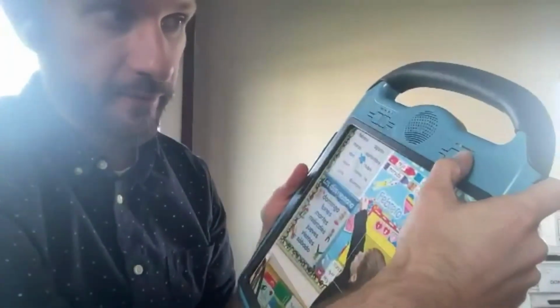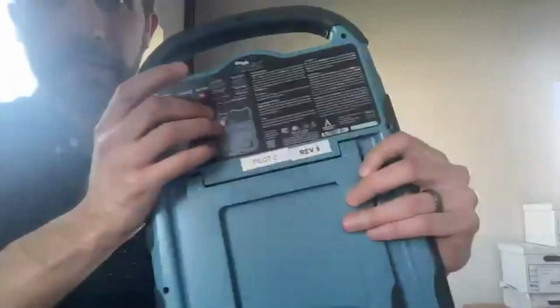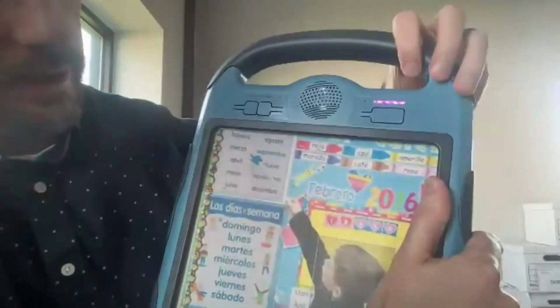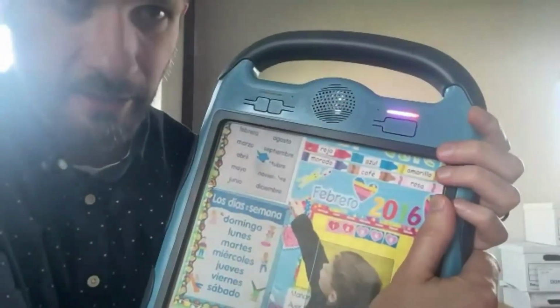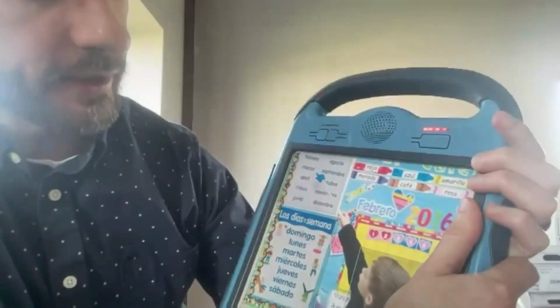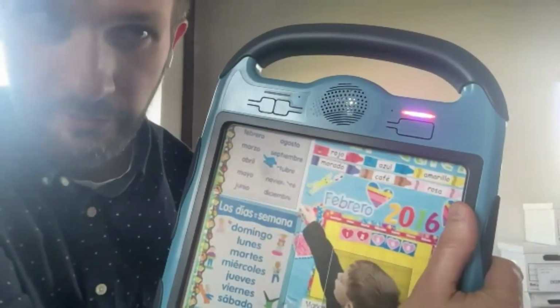So I'm going to go to a different level just to make sure. Right now, as far as the device is concerned, this is just a blank canvas. There is that record button on the back. When I hit it once, there is one little red light on the front to indicate that I'm in my standard record mode. If I hold the record button and let it go, I now see two red lights, and I'm in a mode where I can record auditory cues.